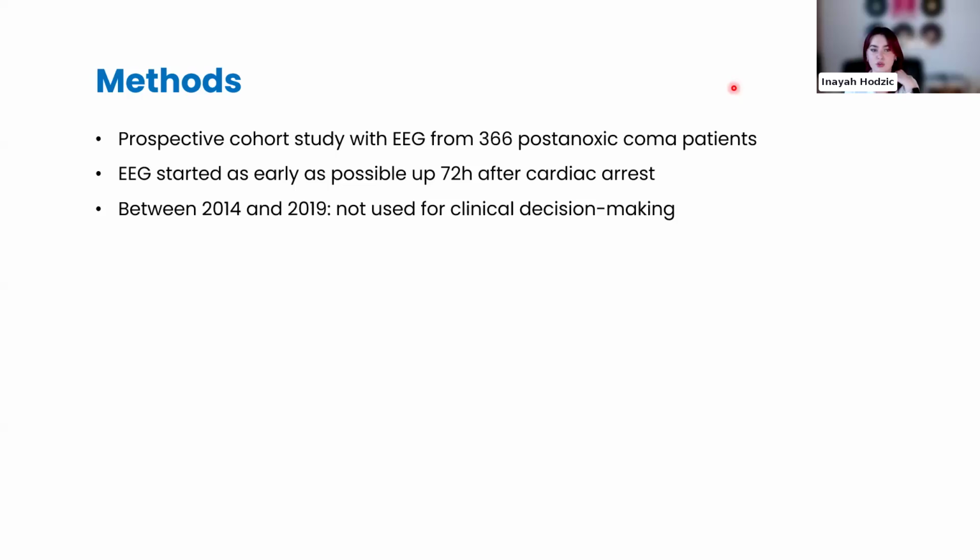And between 2014 and 2019, so a span of 5 years, the EEG that was reported continuously was not yet used for clinical decision making, as it was not yet part of the protocol or guidelines. But as such, we believe that that was not subject to self-fulfilling prophecy, which I will come back later to.